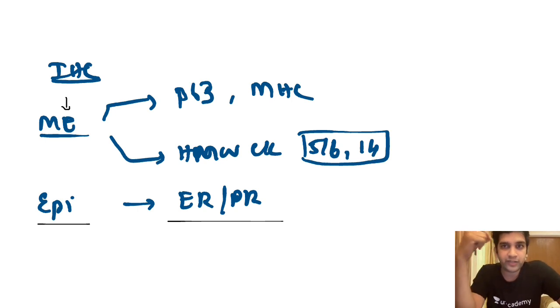I'm sure you must have read this even during your hyperplasia versus DCIS. In a hyperplastic non-clonal proliferation, I will have heterogeneous positivity of ER and PR. That's what happens. But when it becomes clonal, be it benign or malignant, especially in DCIS and in your carcinomas, my ER and PR become extremely strong. That's for the epithelium, right? So that's very, very helpful for you to differentiate.